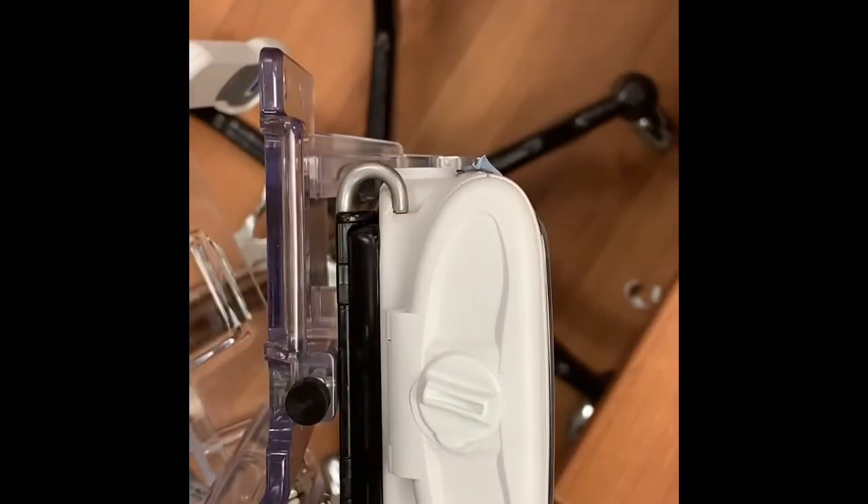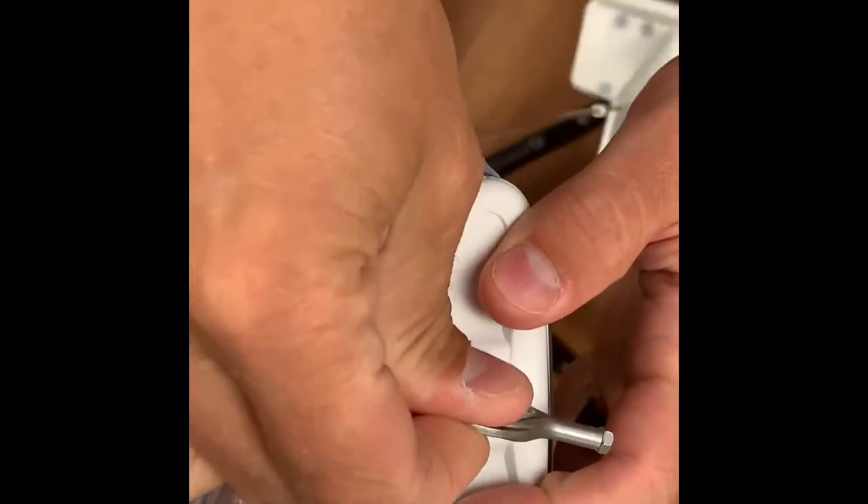With new batteries loaded, close and lock the compartment. Now your PCA pump is ready for use.